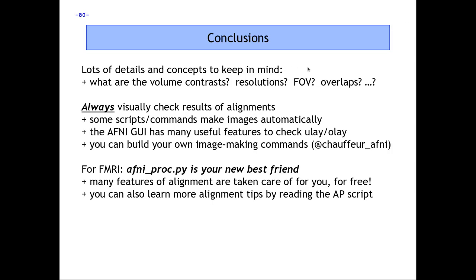In summary, whenever you're aligning to a template or between different subjects, nonlinear warping is the way to go. For template alignment, @SS_warper is particularly recommended; 3dQwarp is a more general case, and @Animal_Warper is for animal studies. Please always check results visually — you can use the images that come out of @SS_warper and @Animal_Warper, or make your own systematic images using @chauffeur_afni. In both cases, results can be plugged directly into afni_proc.py, and this modularization of analysis is useful and hopefully fairly efficient.